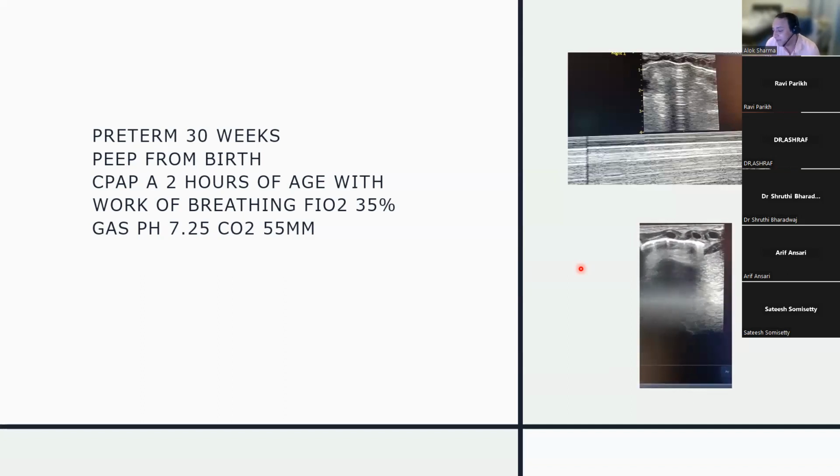Okay. So, this baby gradually got better. And from our perspective, about 900 grams, technically got away without a tube for a few days and then had a secondary deterioration with some sepsis. But it's a good example of what I would say is the importance of clinical correlation alongside doing lung ultrasound. And really, the X-ray appearance also showed a very small right anterior pneumothorax with what looked like, I would say, spared lungs. You kind of stressed IUGR baby.